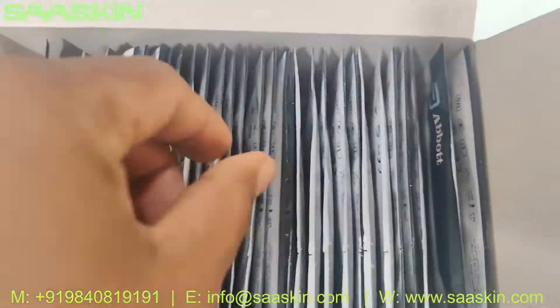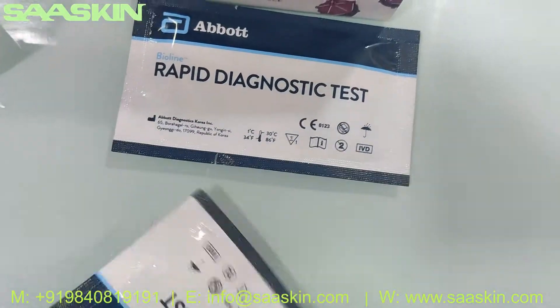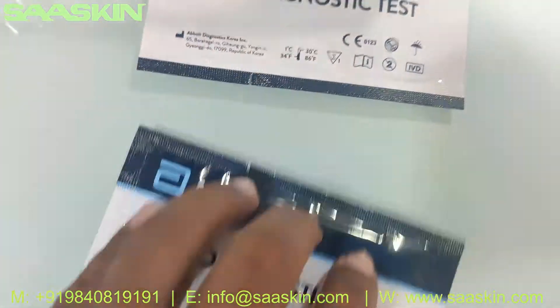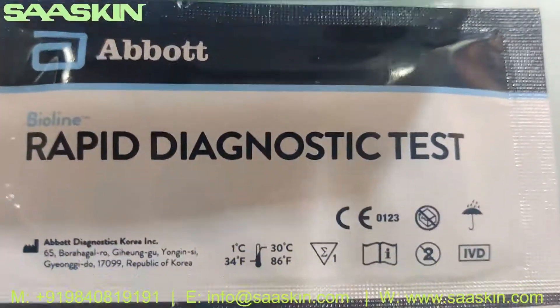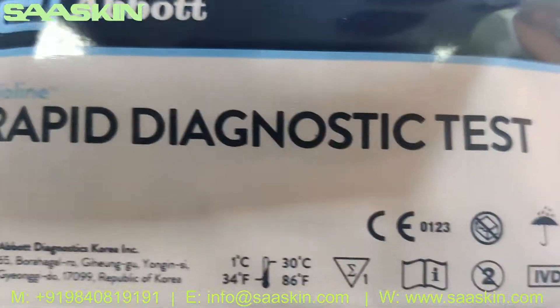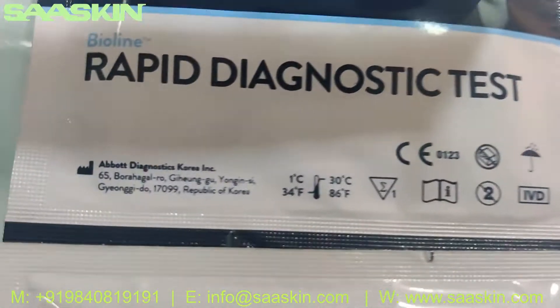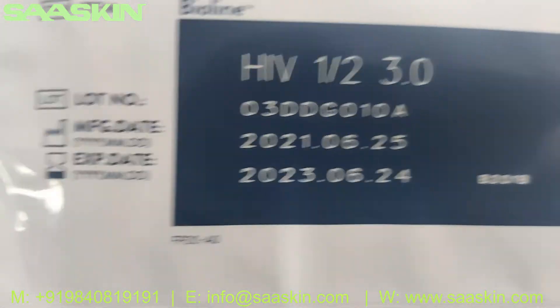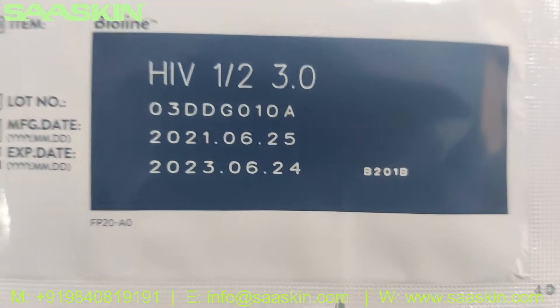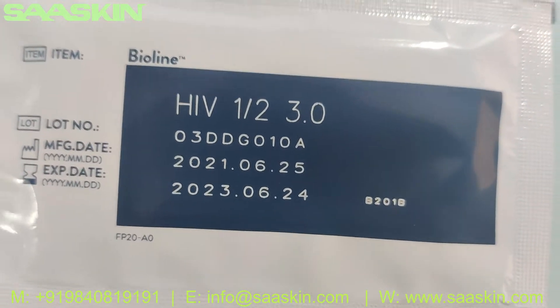Inside you can see the 30 test cassettes — I am going to pick two test cassettes for you. This is the manufacturer in Korea, and you can see the expiry period on the label: two years.